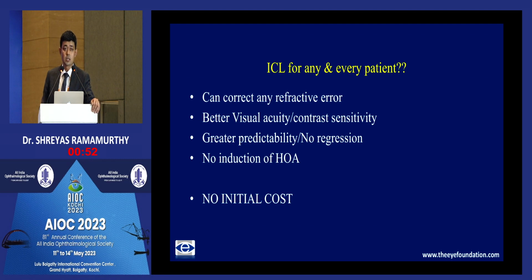So for a center which is starting out with refractive surgery, if you're looking at a 3 crore investment of an excimer laser or just wanting to do phakic IOL, this is definitely an idea worth thinking about.